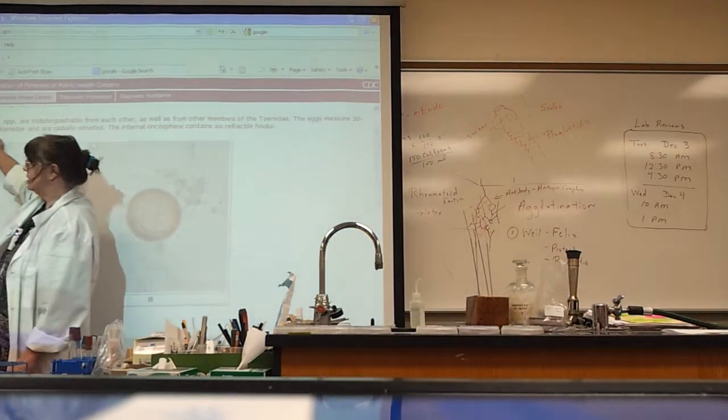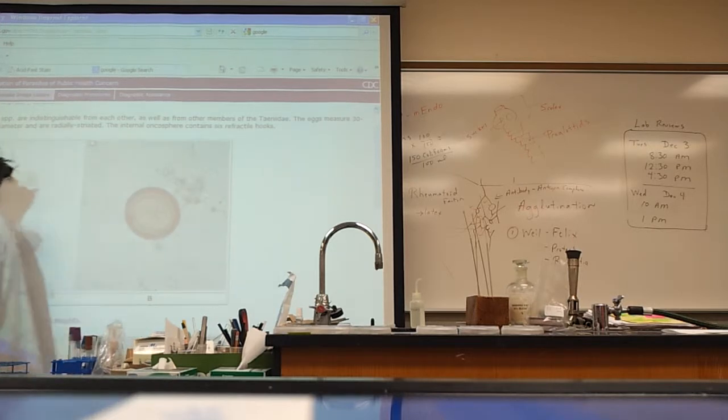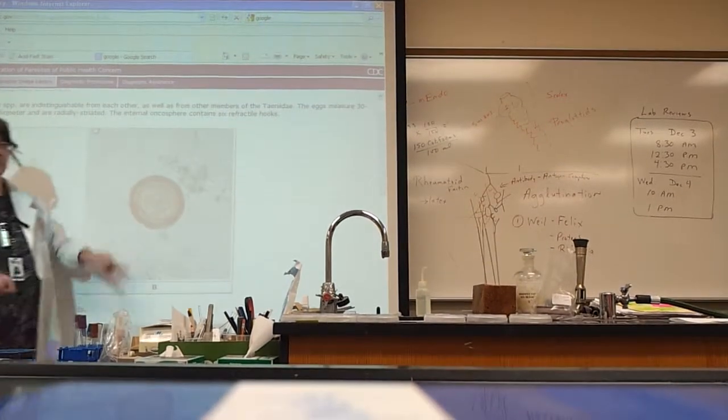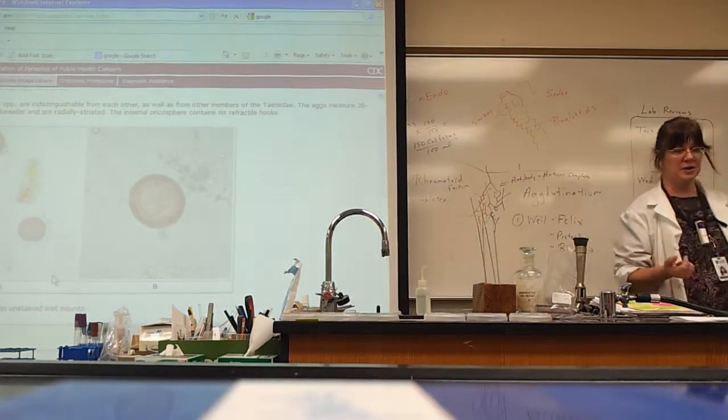Double-walled coin. You have a double-walled coin, that's the egg. Here is Taenia, scientific name, Taenia species. Don't say Tinea, because T-I-N-E-A is what? Ringworm. Don't say T-I-N, that's ringworm. Taenia, T-A-E-N-I-A, double-walled coin. Of course, proglottids filled with eggs, scolex and suckers.